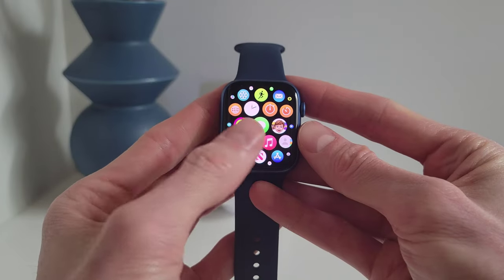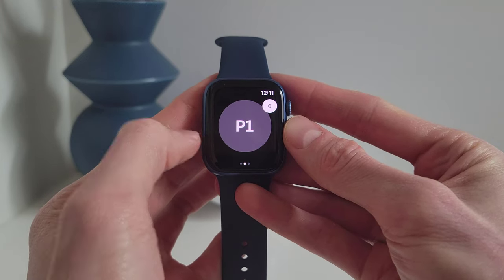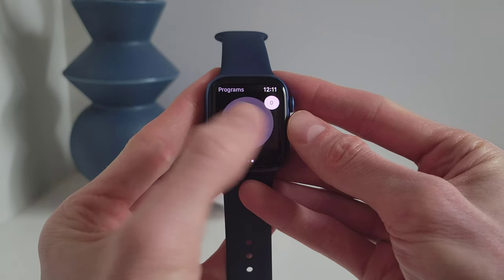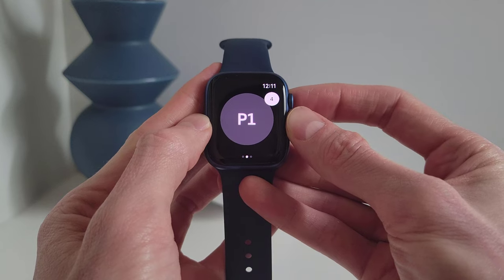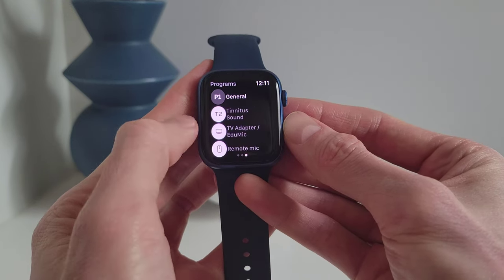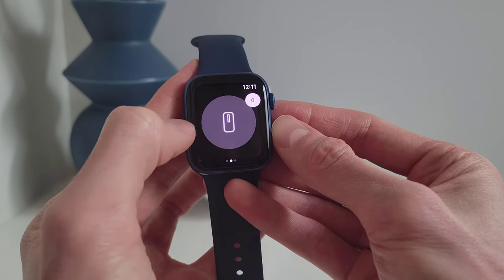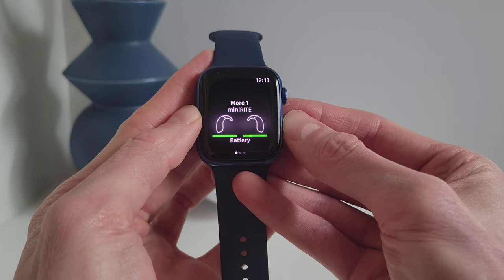With Oticon and their Oticon On app, you can control your Oticon More hearing aids from your iWatch, which will give you access to three different screens. This will allow you to change your volume levels by using the crown on the side of the watch. You can change between different programs and activate different accessories using the touchscreen. And you can even see the battery life remaining in your hearing aids.